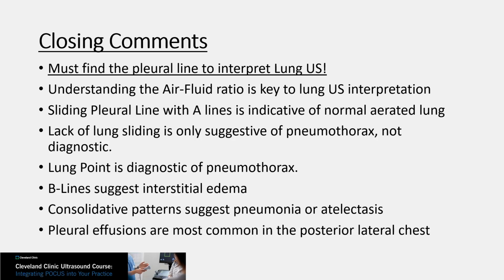Lastly, pleural effusions are most common in the posterior lateral chest and should be a place to look at whenever you're doing your lung ultrasound protocol.